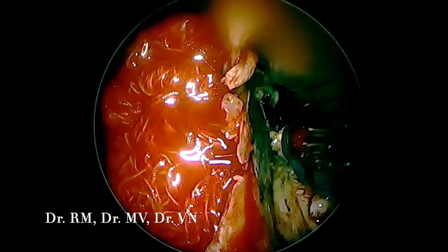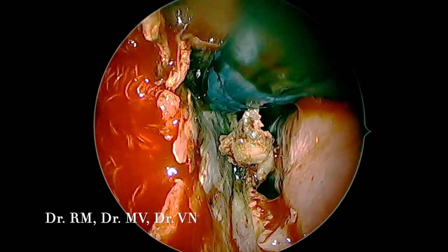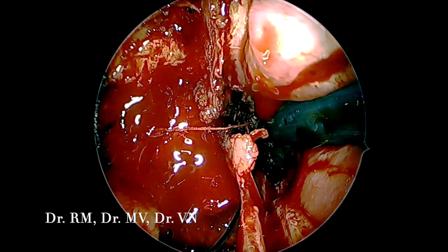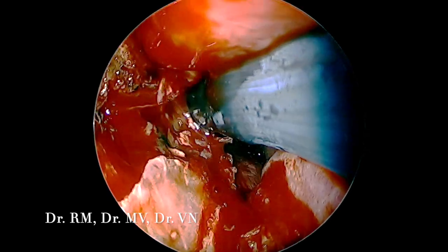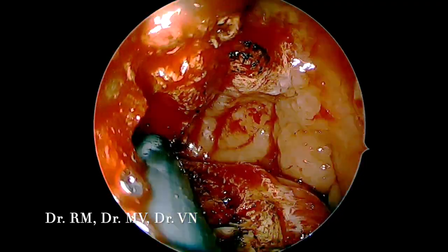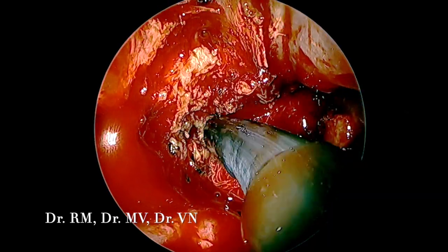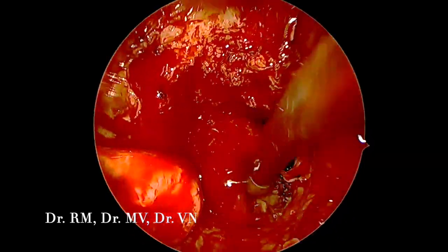Meanwhile, we are removing the attachments and the remaining mass, and all that area has been cauterized. So we are very sure of the plan of completely removing it. This is a very unique case. As soon as the mass was excised, we sent it for biopsy and it came back as JNA. You can see how we are cauterizing the bleeding spot. The last final attachment of the mass posteriorly is also detached, and the mass is free.